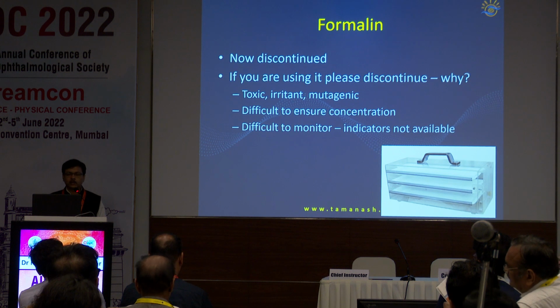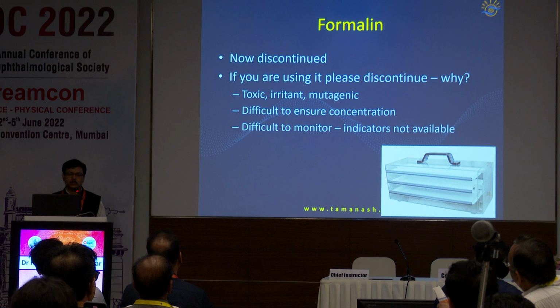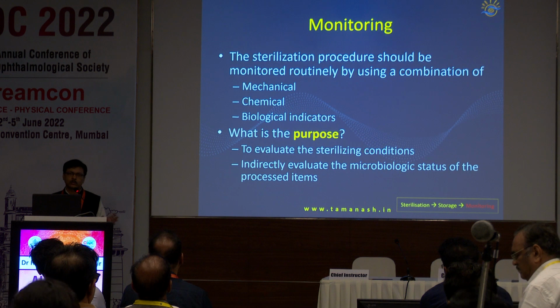Formalin is now discontinued for many reasons. It is toxic, irritant, mutagenic. Most importantly, it does not ensure a smooth, totally distributed concentration, and it is very difficult to monitor because indicators are not available. So if you are using a formalin chamber, it's time to get rid of it. You should now switch over to ethylene oxide.